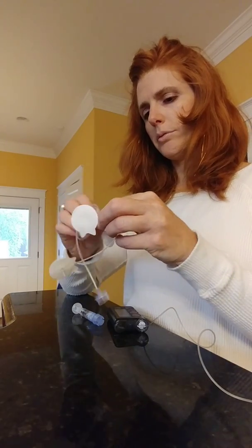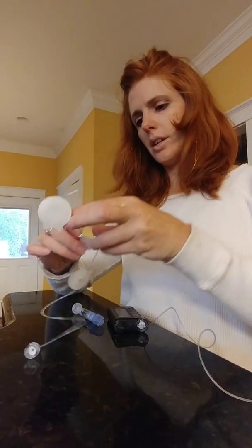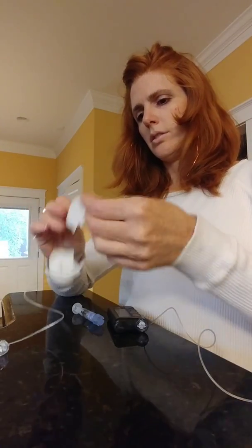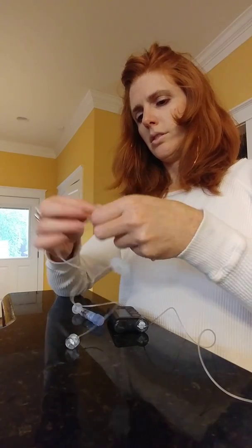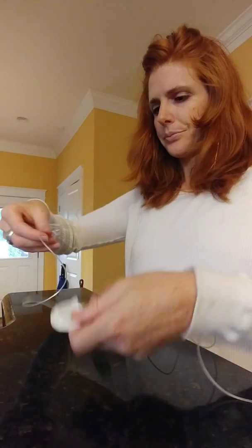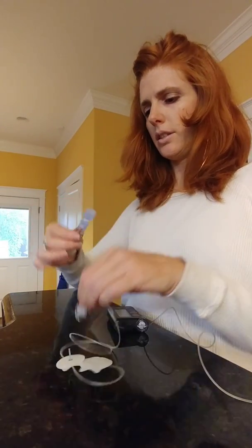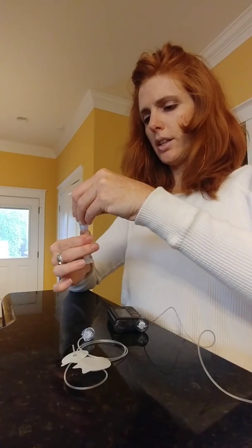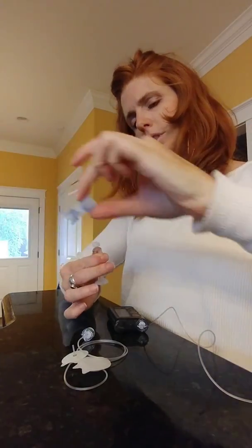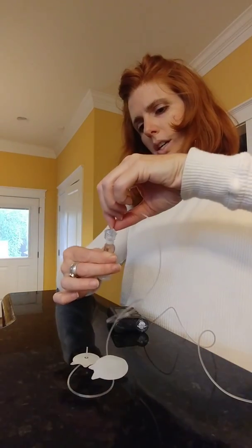Take the paper off. So the site is that short piece. Going to connect it to the tubing. And now this cap here is what's going to go on the end of the insulin. So first thing is I twist and pull straight up to remove the blue needle, and it's nice because the needle's actually covered, so it's hard to stick yourself.